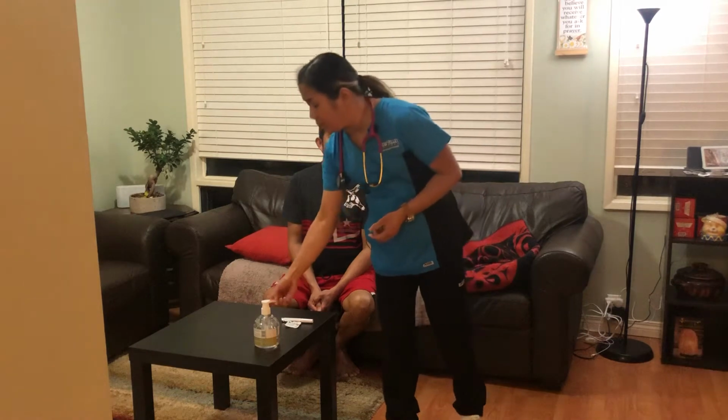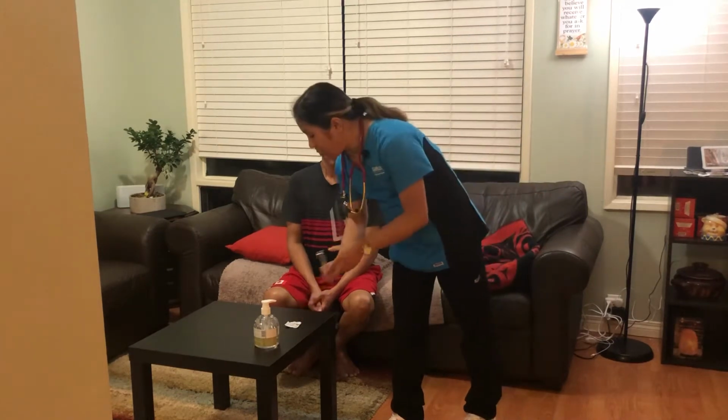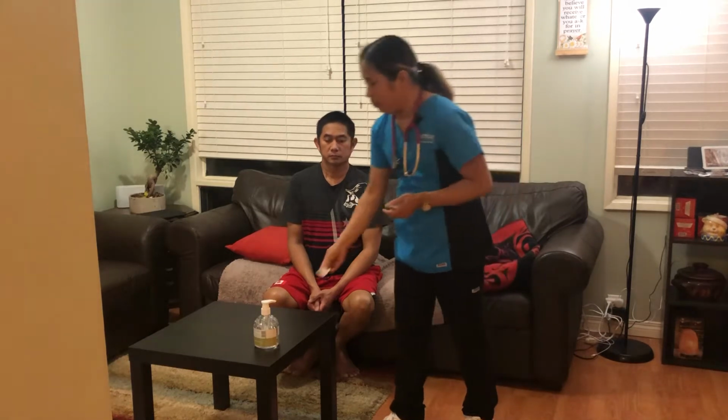I'm wearing my complete uniform and I'm going to wash or sanitize my hands. I have here my stethoscope, my pin light, and the alcohol swab that I will use to clean my equipment. I'm going to clean the pin light and also the diaphragm and the bell of my stethoscope. Now I am ready to perform the head to toe assessment.